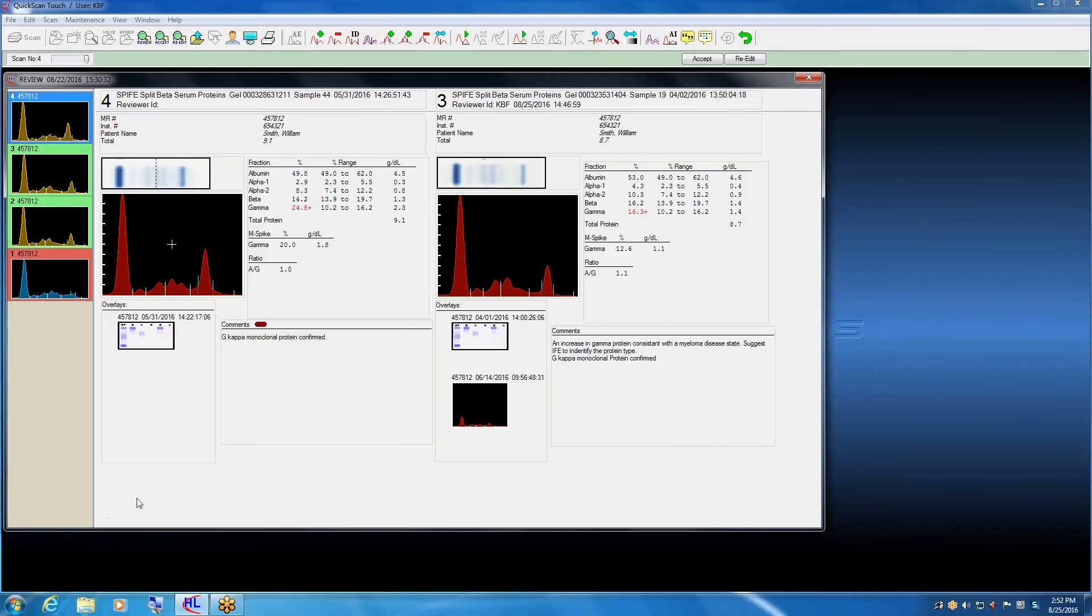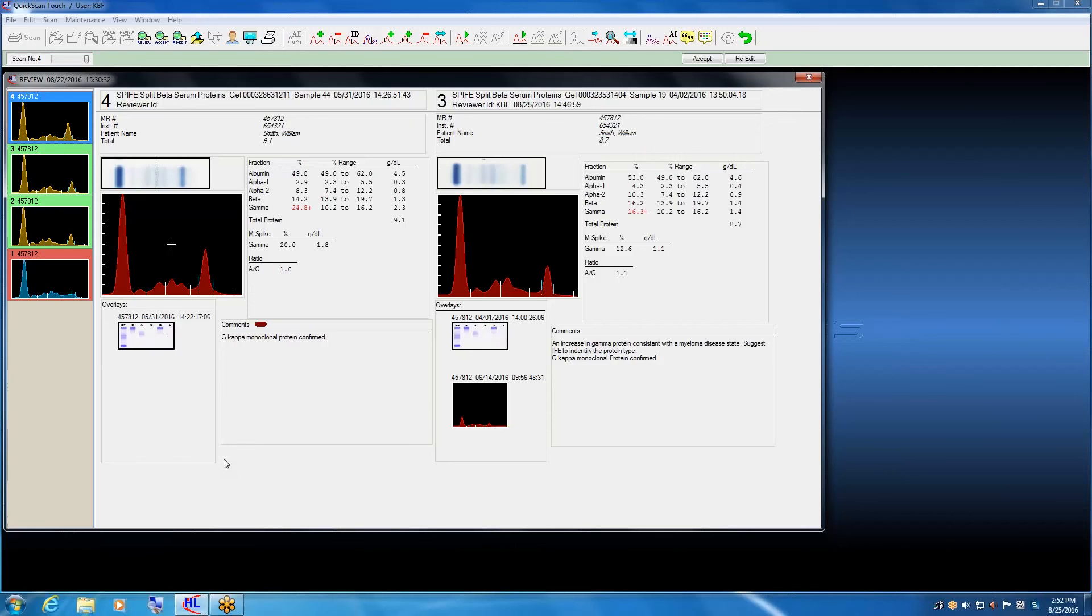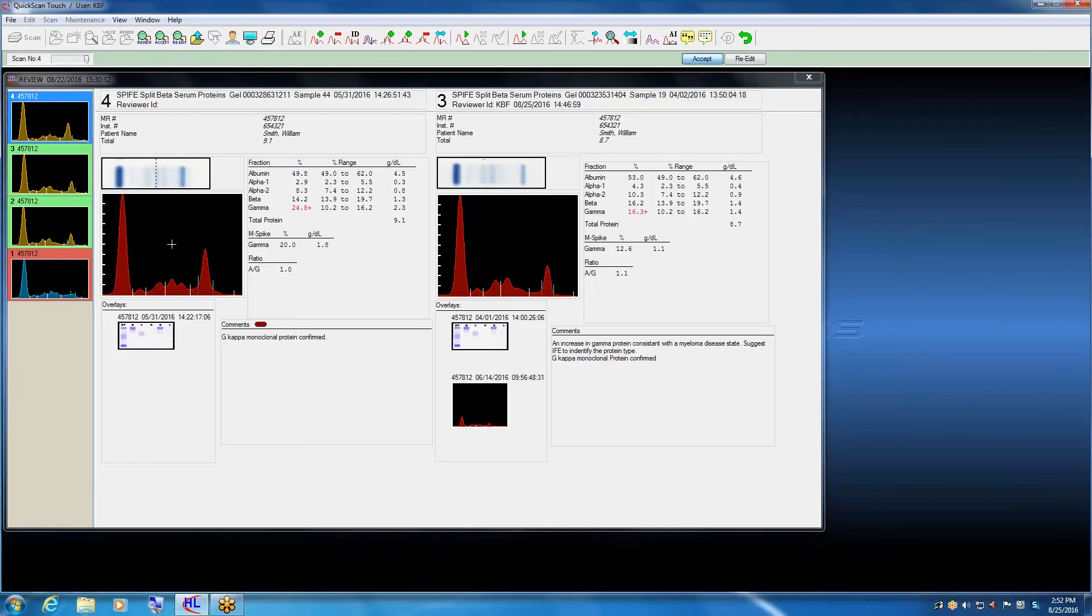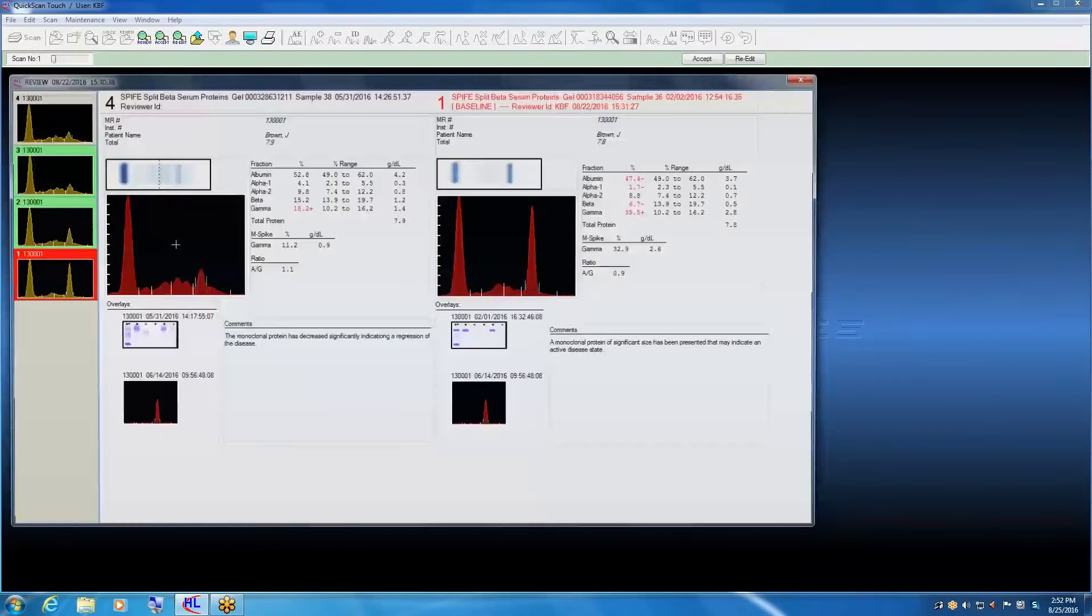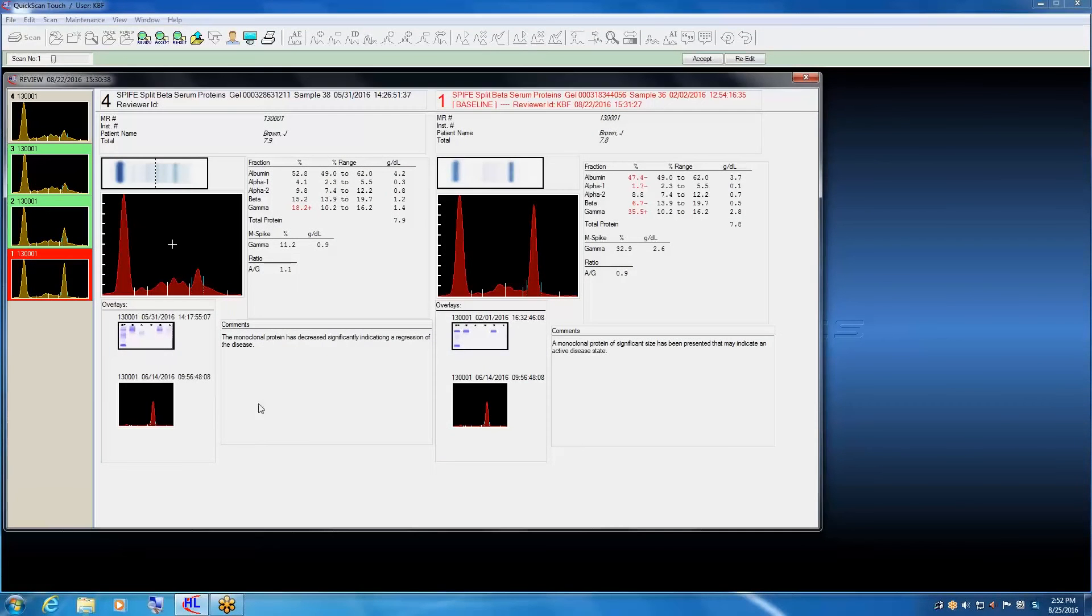Once the pathologist has finished with the review for this patient, they simply send it up to the accept folder. It gets time stamped and signature stamped at that point and is basically locked.